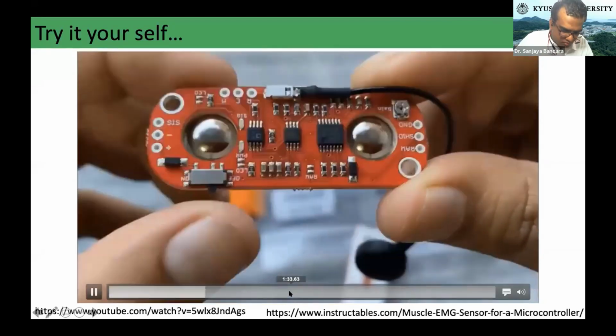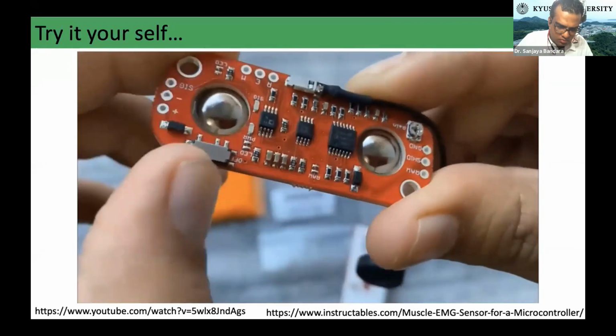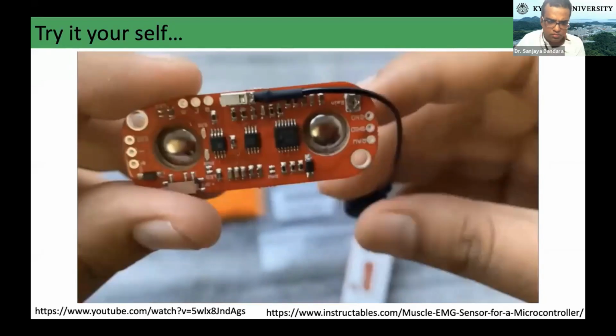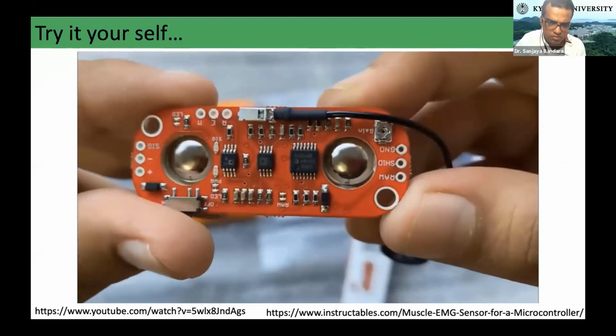EMG measures the electrical activity of a muscle during rest, slight contraction, and forceful contraction. Muscle tissue does not normally produce electrical signals during rest. When an electrode is placed, a brief period of activity can be seen on the oscilloscope.